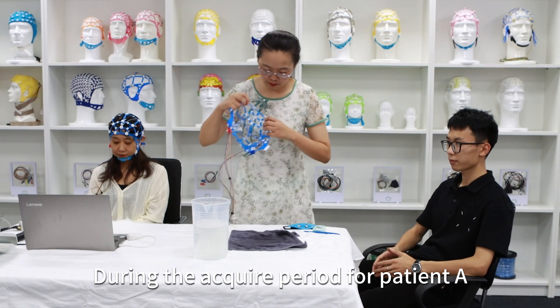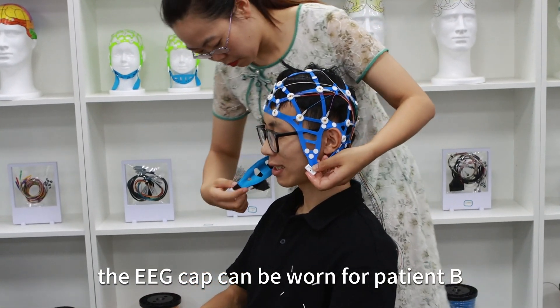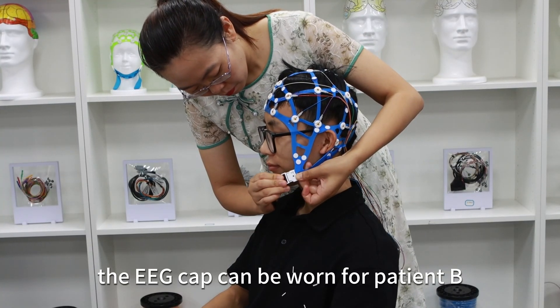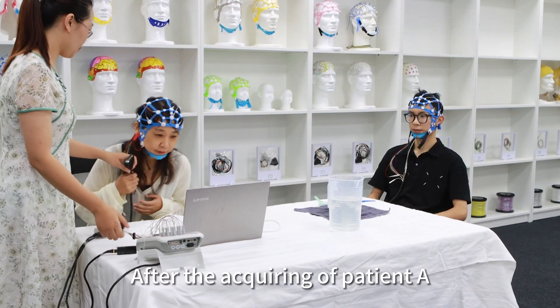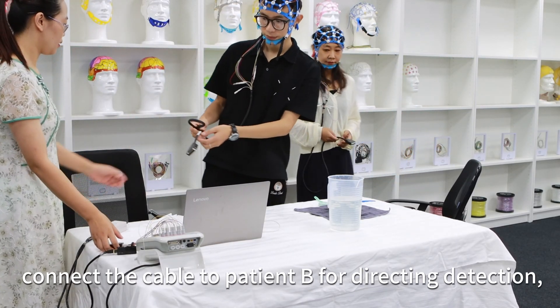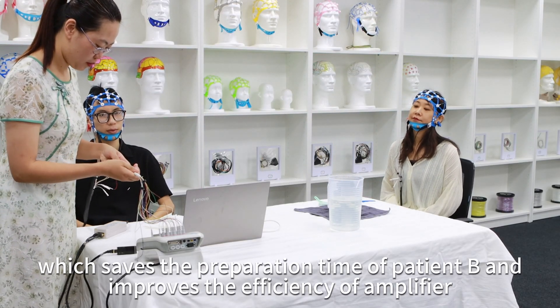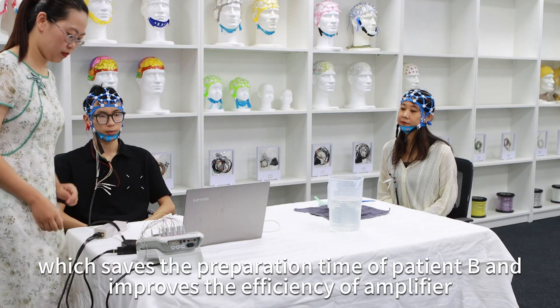During the acquisition period for patient A, the EEG cap can be worn for patient B. After the acquiring of patient A, connect the cable to patient B for direct detection, which saves the preparation time of patient B and improves the efficiency of the amplifier.